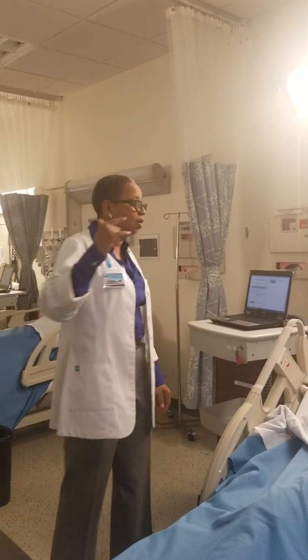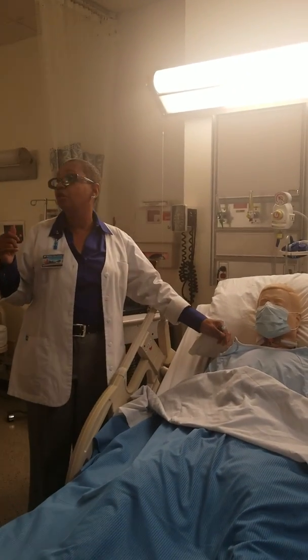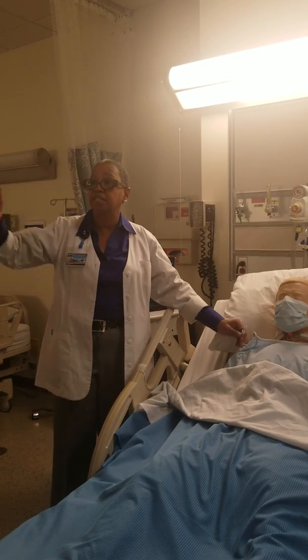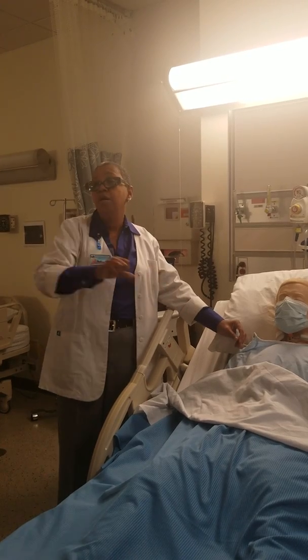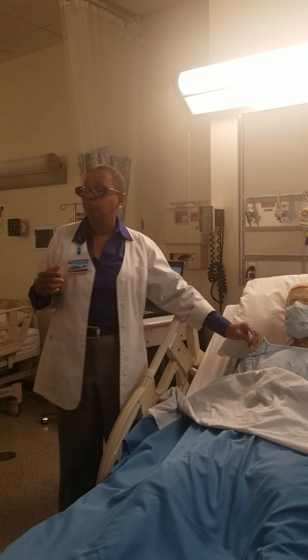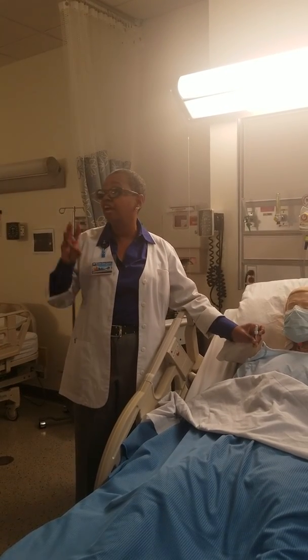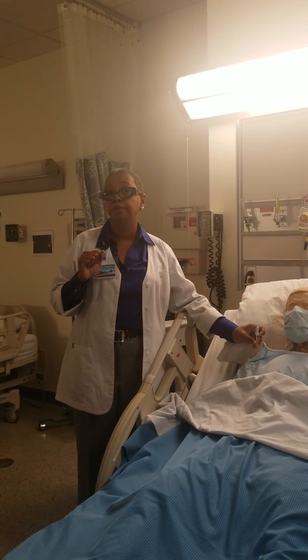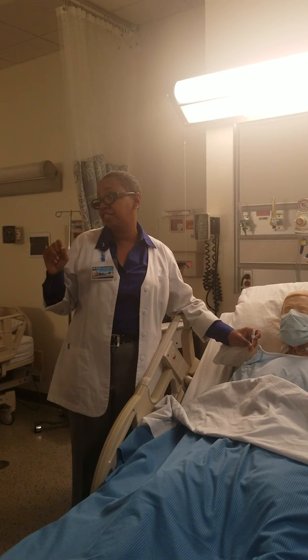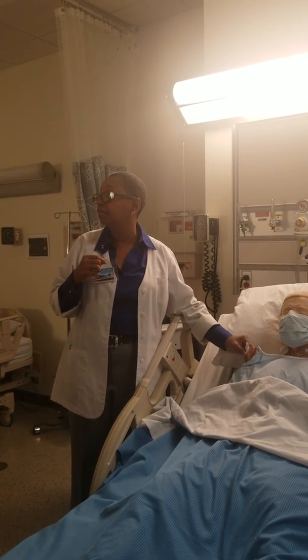If you got a central line and it is a single lumen such as this, we hope it draws blood and stuff like that, but we really don't have a whole lot more access than just a little peripheral. It's central, but I don't have any more. When they're talking about triple lumen, they're talking about the number of lumens that you have. This is single. If I had 3 of them, that's a triple lumen. Okay, so you can have a PICC, but do you have a dual lumen or a single lumen PICC? Lumens mean how many access ports do you have? Okay, does that make sense?